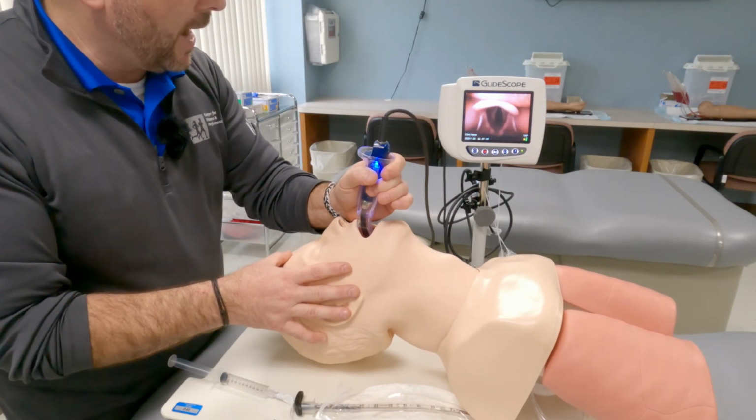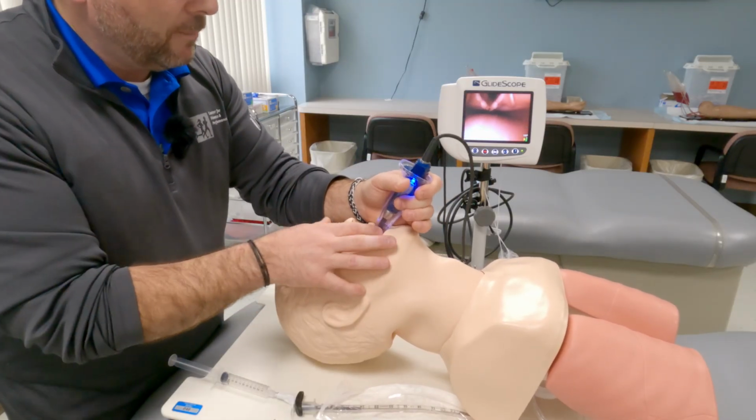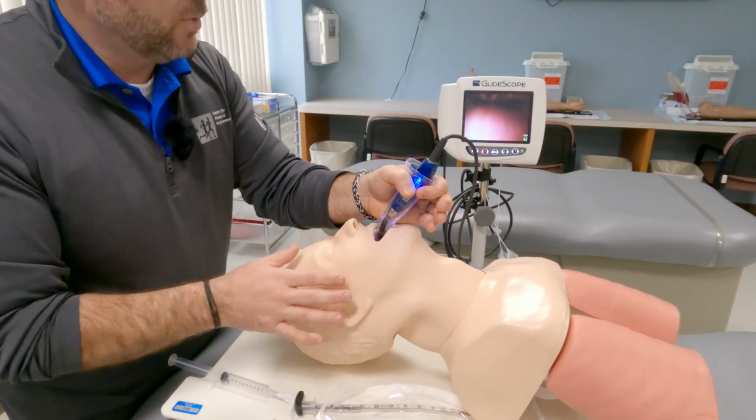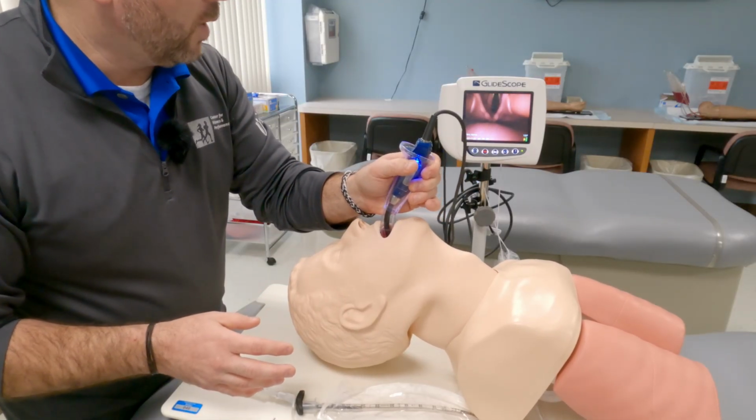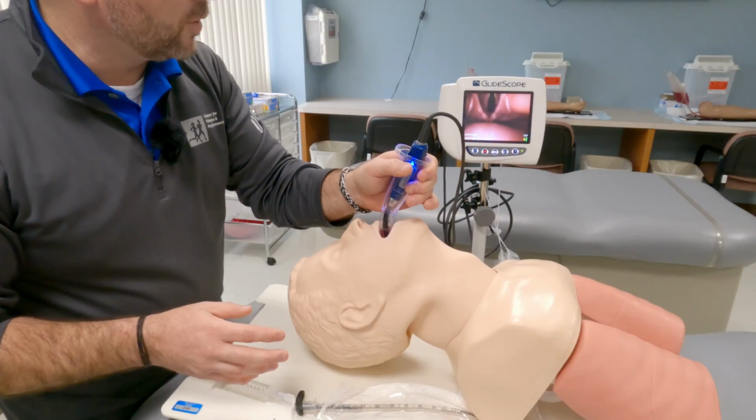But I'm going to go in like this, and then I'm going to lift up. I'm not going to crank back. You can do a little bit, but you're going to put too much pressure on the teeth. You want to lift up. So go straight down, lift up. Wow, look at that. I can see beautiful cords right there.